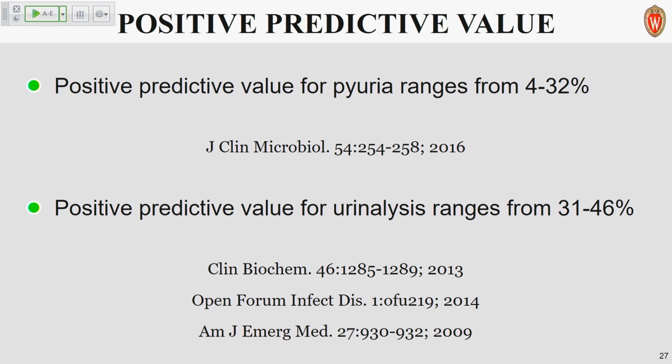So we gave those examples to see if a UA result influences a tech to perhaps change a report. And it looks like it did in some of the instances, especially if you have gram-negative rods. But when you look at the literature, a lot of the UA data is not terribly predictive in a positive predictive value sense. Next slide.